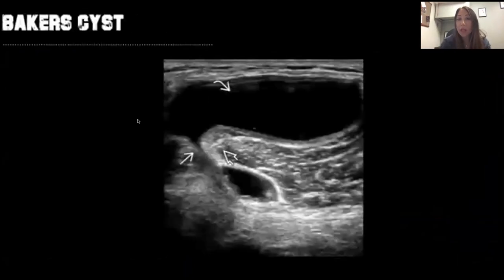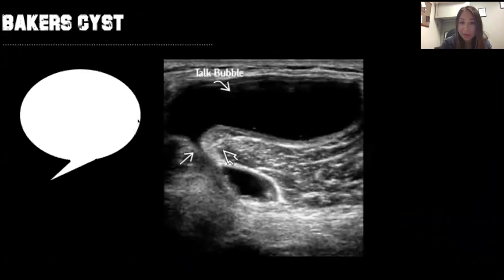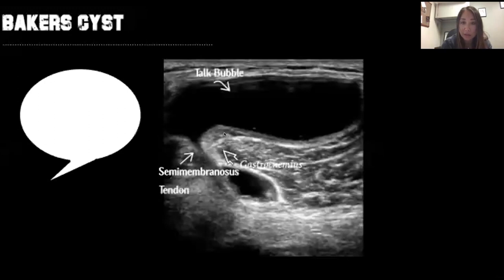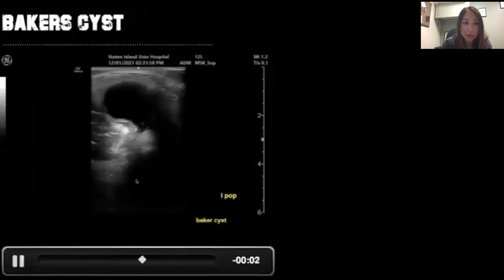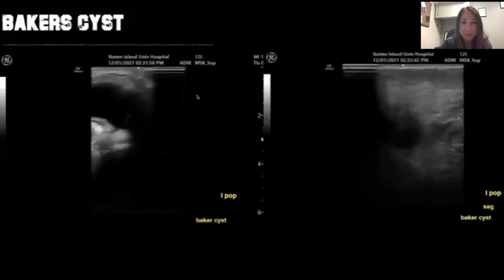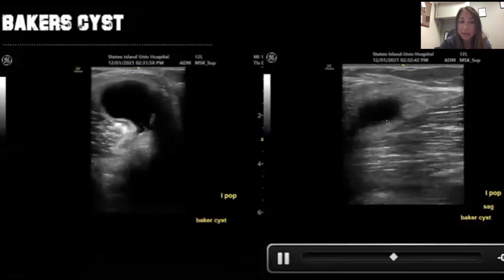Let's talk about effusions. Patients often complain about pain in the posterior knee, and while you want to rule out DVT, a lot of times they'll have Baker cysts. Baker cysts are very easy to diagnose — they have a talk-bubble appearance in the posterior aspect of the knee, and on each side you'll see the semimembranosus tendon and the gastrocnemius.